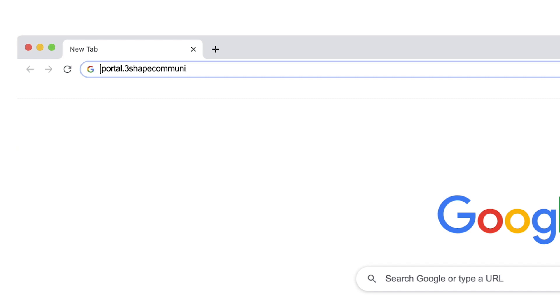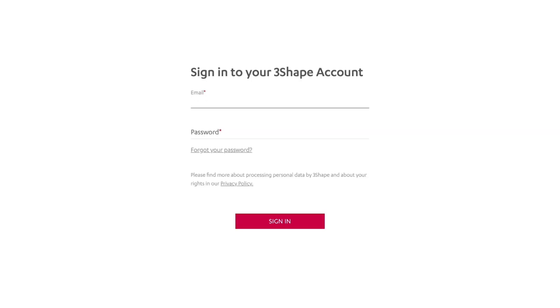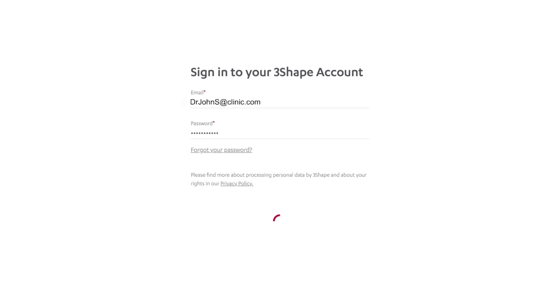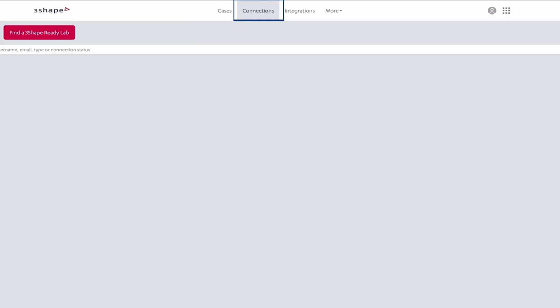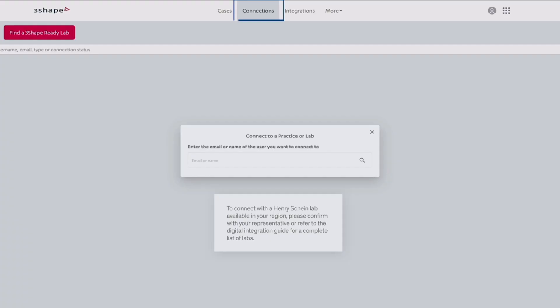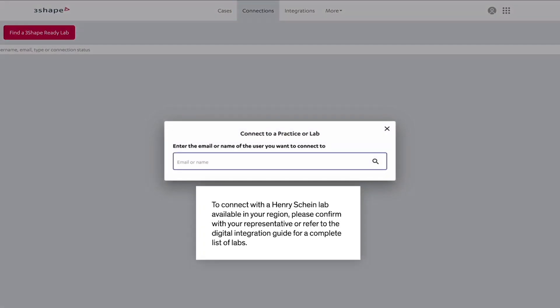Access portal.3ShapeCommunicate.com in your browser. Log in with your 3Shape account. Click on the Connections tab. Click on Add Connection.